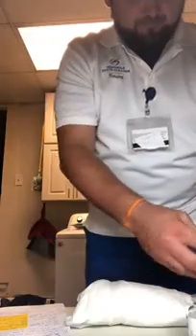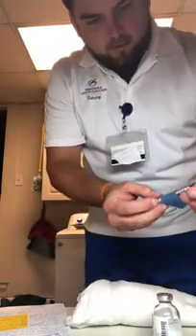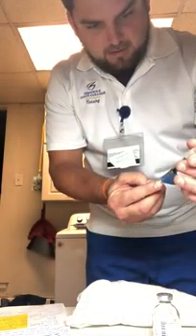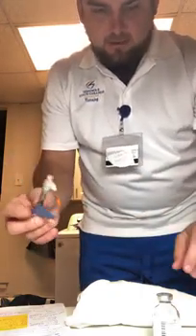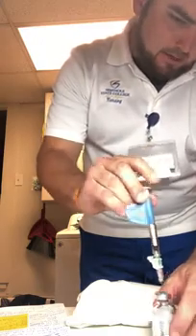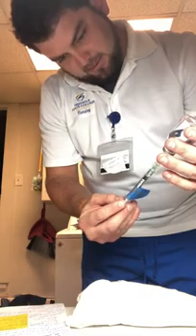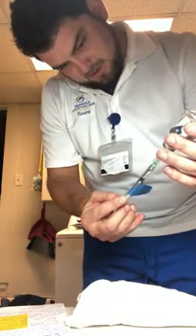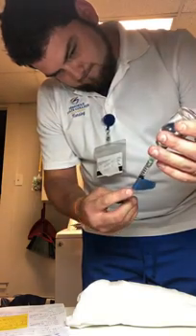So we've got our alcohol swab. We're going to clean this. We're going to get the syringe. We're going to pull back the amount that we need. We're going to uncap our needle, and we're going to insert the needle in, inject the air in. We're going to invert, and we're going to draw out as much as we need here without getting any air bubbles.